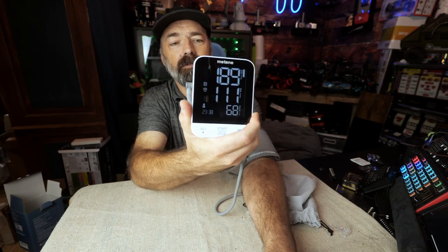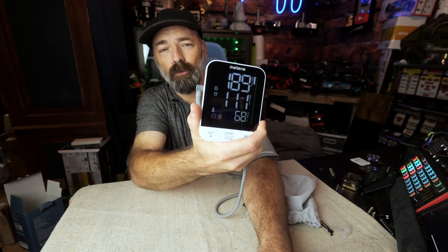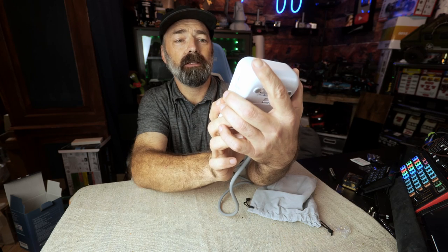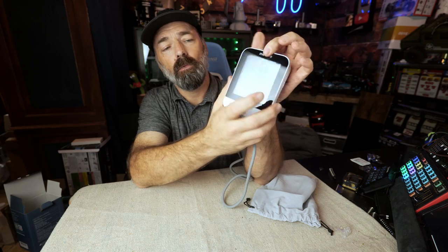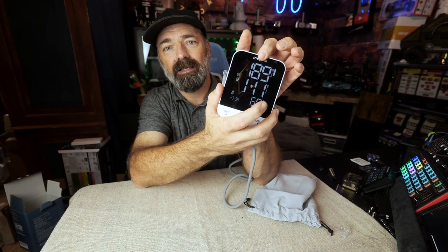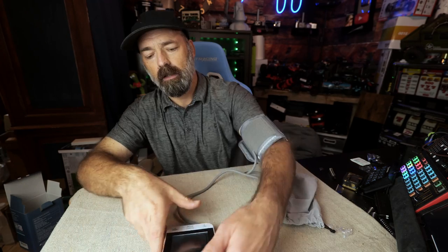And there you have it — 189 over 111. That's a little higher than I normally run, but due to all the movement. If I wasn't moving I'd probably be at 173 over 90. I'm starting to relax a little and you can see it dropped to 176 over 101. I've been running around crazy all morning and that's pretty normal for me.